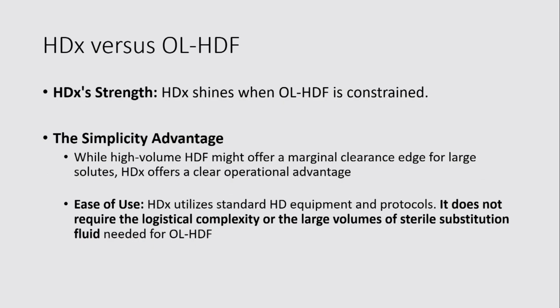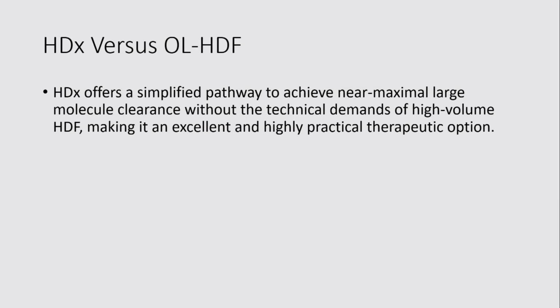So if you compare both of them, the strength of expanded hemodialysis is when online hemodiafiltration is constrained because of various reasons as mentioned earlier. And there is ease of use of expanded hemodialysis, which requires less logistic complexity. So expanded hemodialysis is a simplified way to achieve near maximum large molecular clearance without the technical demands of high volume HDF.